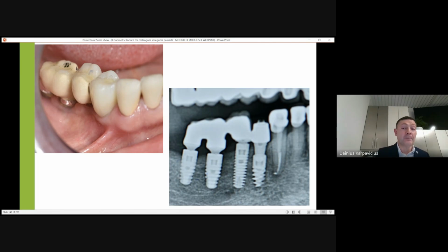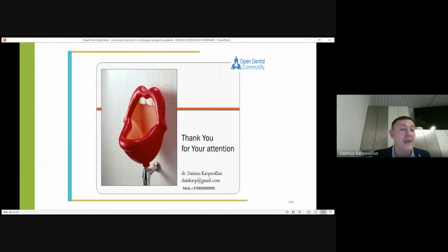We put our implant, we submerge this implant. I am not sure, but it might be 2, 3, maybe sometimes in some place 4 millimeters, because it was horizontal. And take a look at the profile. I'm sure that for the future, it will have many more possibilities compared to what we had previously. So, as I said, for today, conometric solutions are the best.